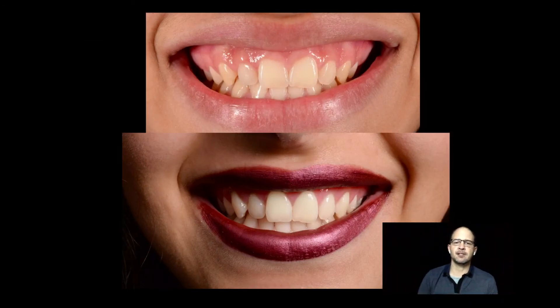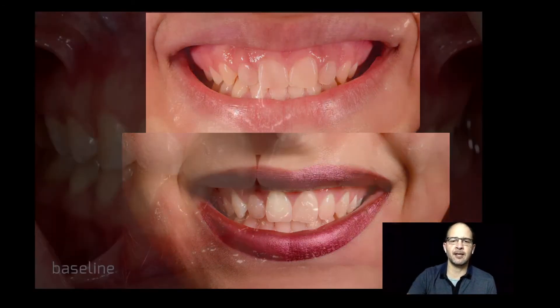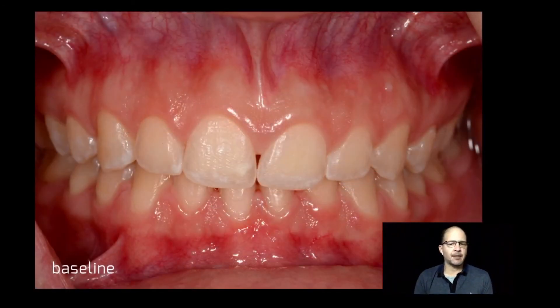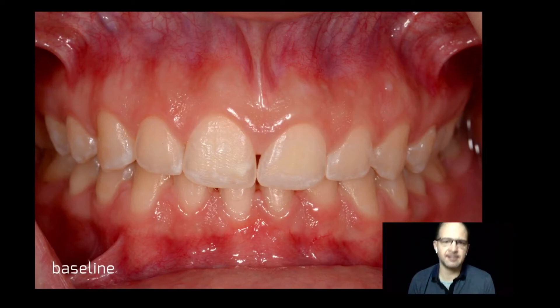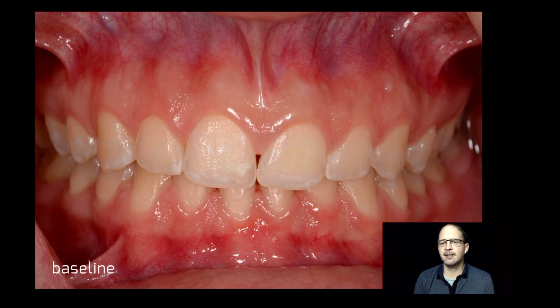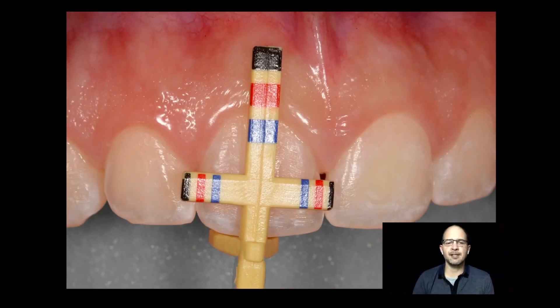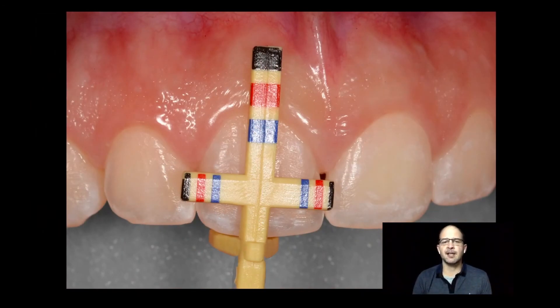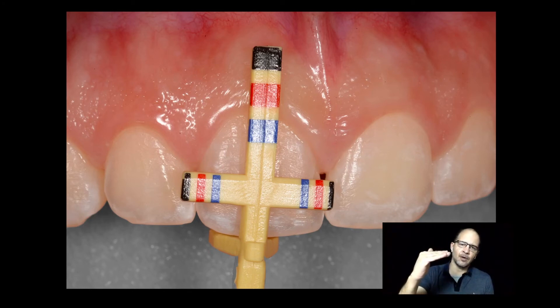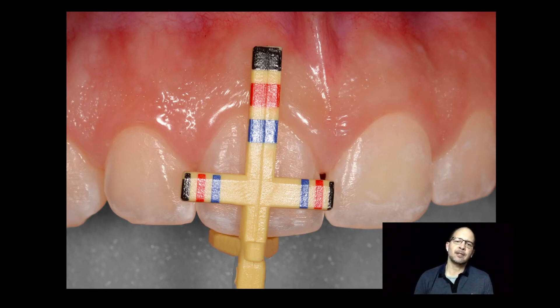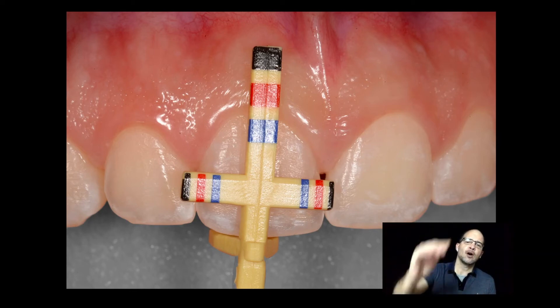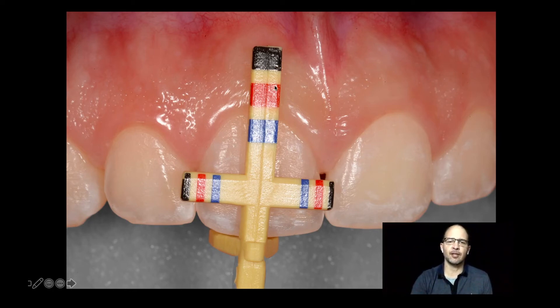Let's go for one more case. This is the beginning of the final case. Look at that — we can see as dentists that this tooth does not have abrasions and the tooth is not in proportion. So once you replace — look at that — the outside portion of the central incisor needs to go to be proportional. Your incision needs to go up to this level here.